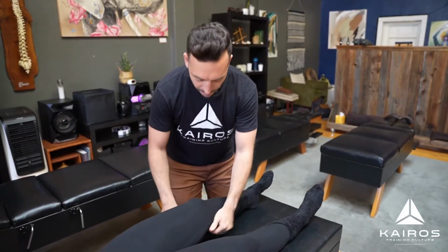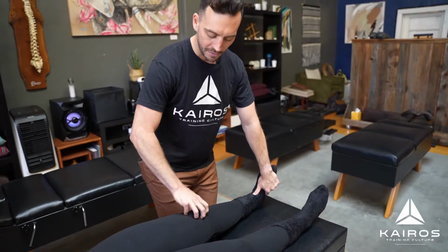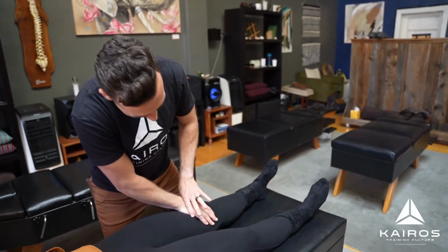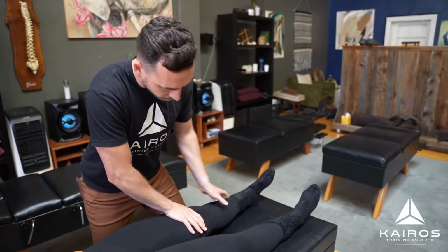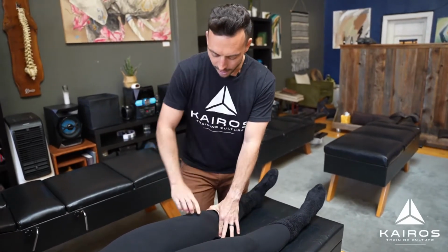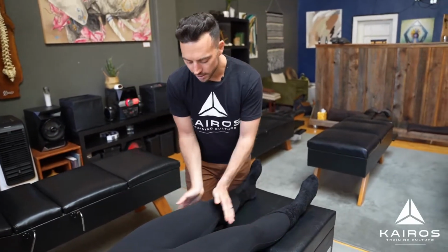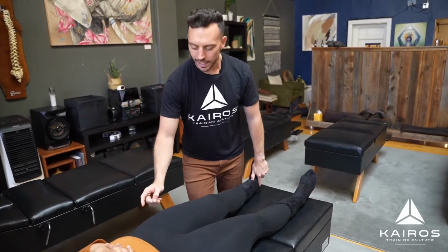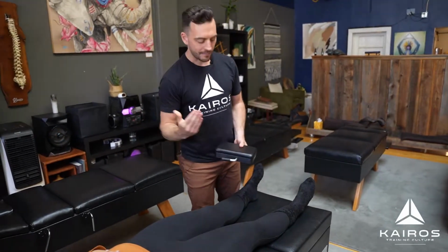And then if I notice that somebody has super tight quads, hyper engaged musculature that's pulling up on the kneecap, then I can contact the patella and go superior to inferior, guiding the kneecap down to get a discharge on the muscles and fascia that are pulling the kneecap up. So you get internal rotation here, dropping that patella down to discharge the muscles of the quads, and so many people find relief with it in their knee and better function of the ankle, knee, hip complex as I use this drop piece.